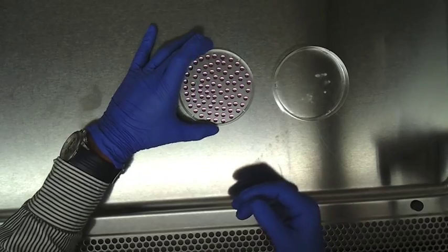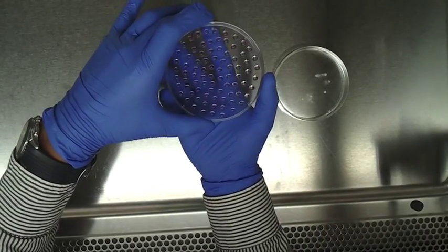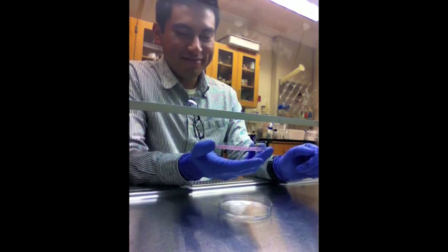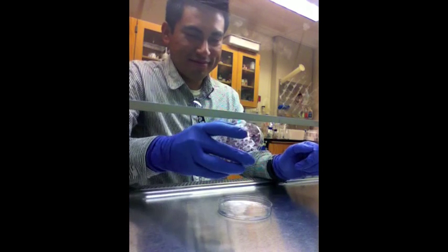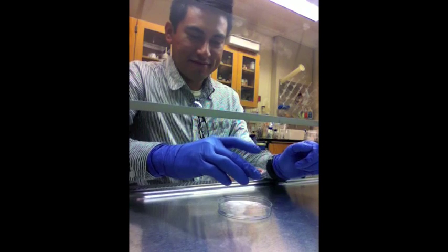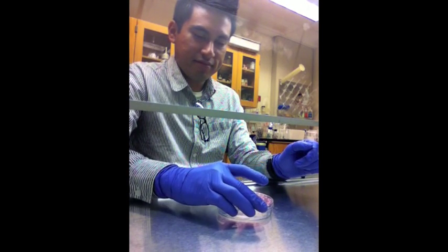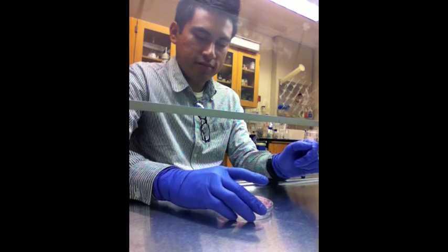Once the plate is completely filled, gently flip the plate over and place it on the bottom of the dish. The culture is then incubated at 37 degrees Celsius.